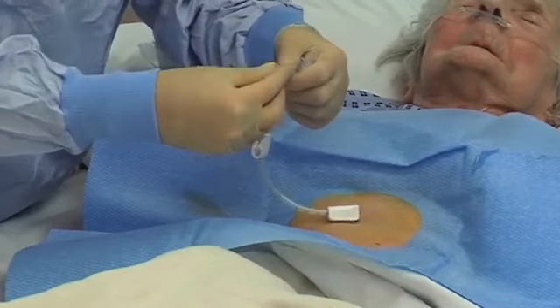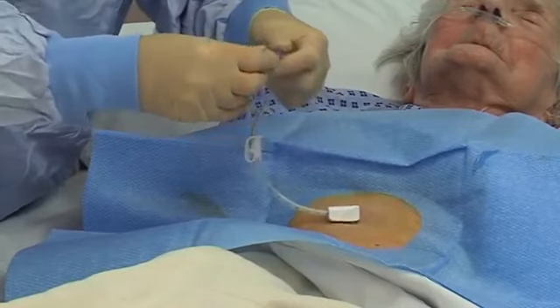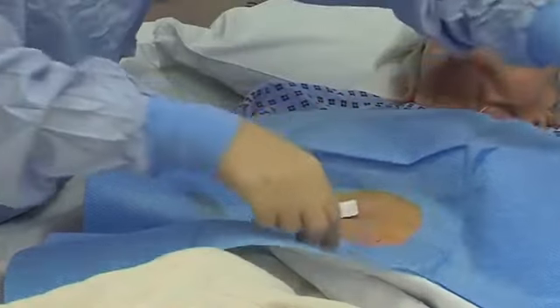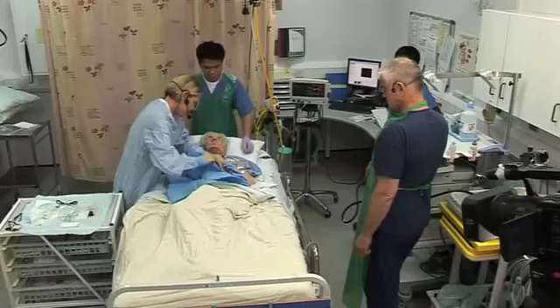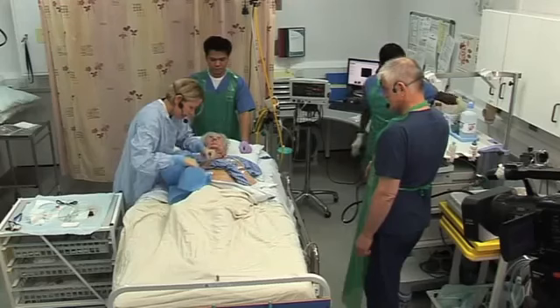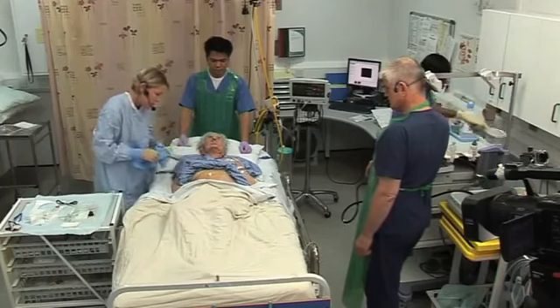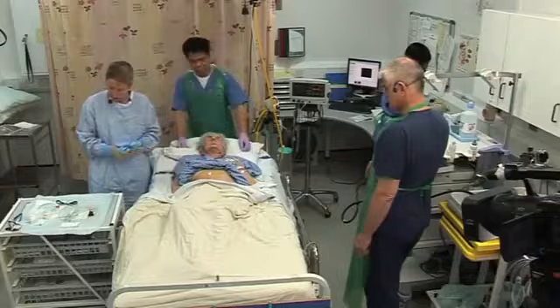Okay. Make sure it's all closed up. And then you can undo the clamp and just remove the drape. We're just going to take this off your tummy. Okay, so we'll check that again tomorrow. Check for any edema or redness, and we can readjust if we need to.